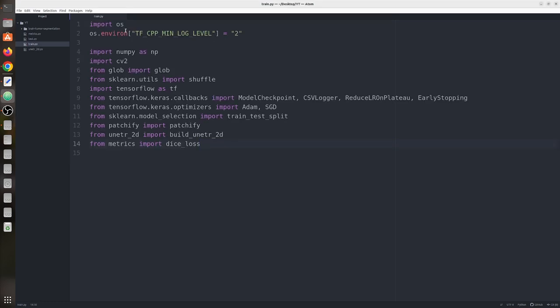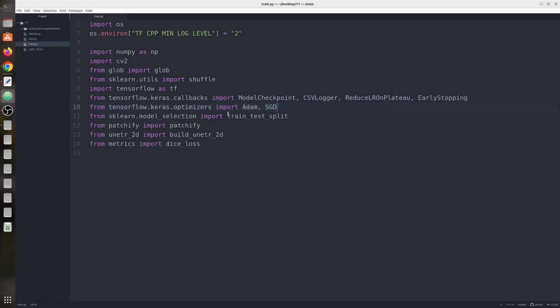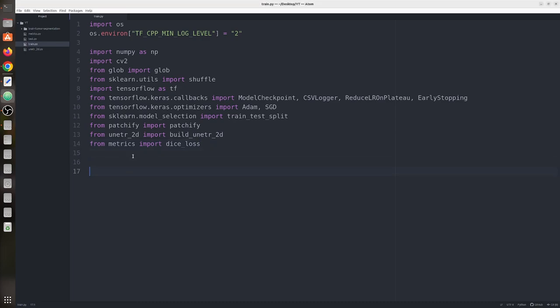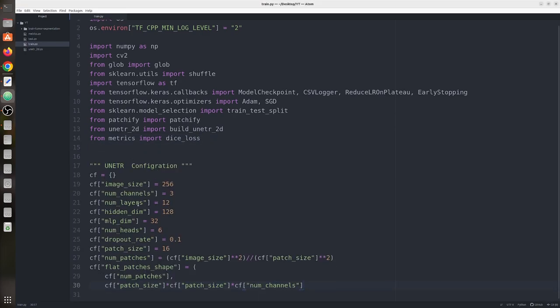Now let's start with the training part. We are going to import all the libraries and functions required for this task, using TensorFlow as our main library. We have a few callbacks from TensorFlow, optimizers — Adam and SGD, and train_test_split to split the dataset into training, validation, and testing. We also have the patchify library to convert images into patches. We import the UNETR model and dice loss. First we define a UNETR configuration containing image size, number of channels, number of layers, hidden dimension, MLP dimension, and number of heads.